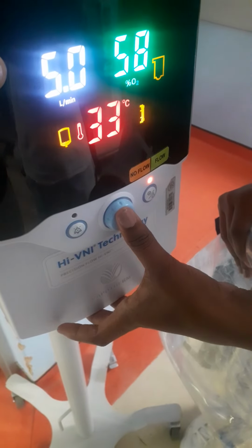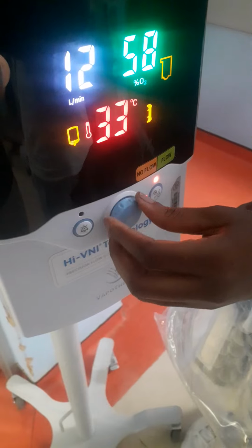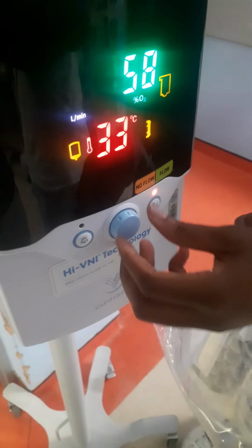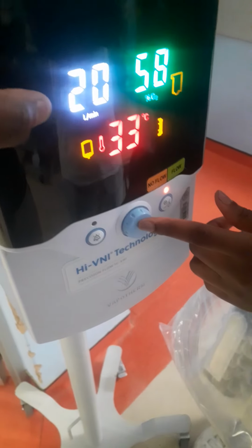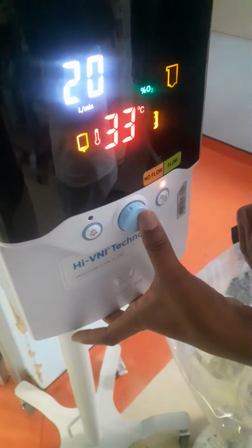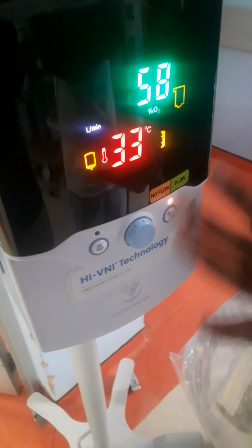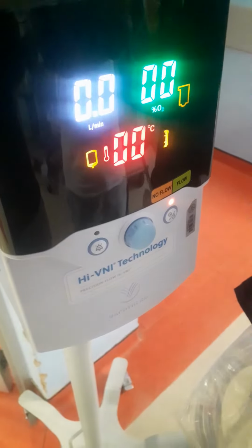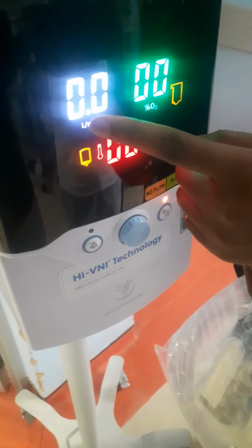Usually, we start on a higher flow. Remember, on nasal prongs it would be 15, but we start higher than that. What is the highest flow that you can do? On this machine, the highest is 40. Other machines can go up to 60, up to 100, but in our hospital, they go up to 60. And then that's our flow.